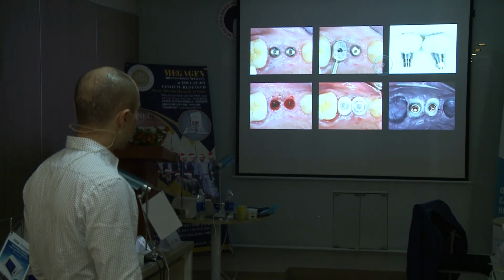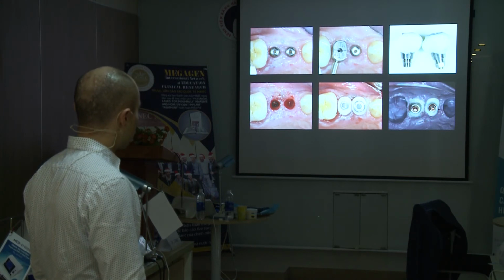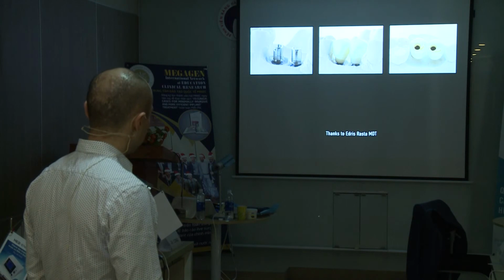And I press this customized abutment in the implant. And also make the impression.